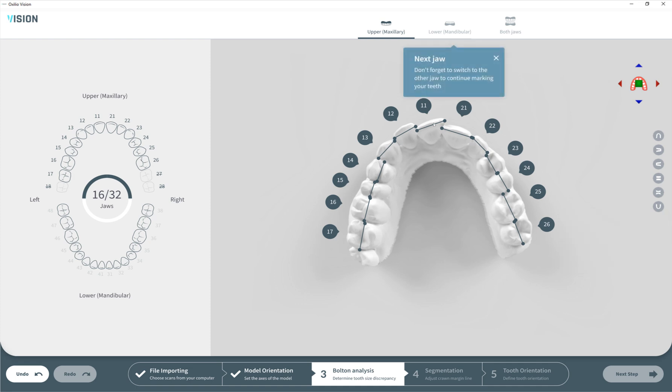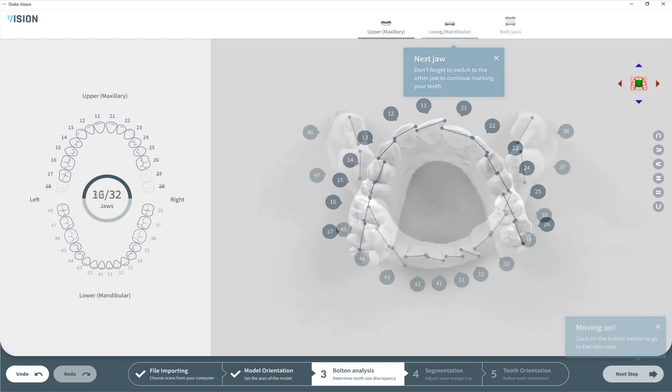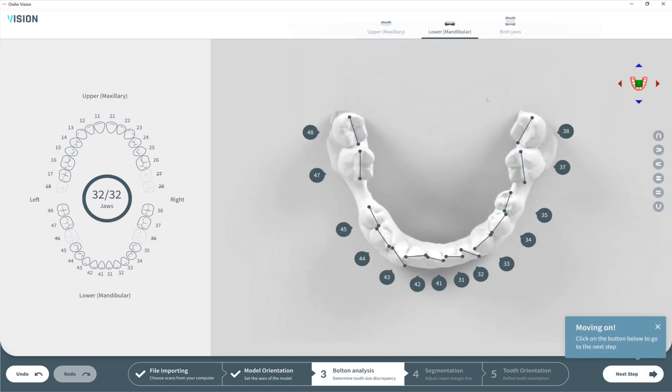Now we need to do the same for the lower jaw. Here everything is done. On the left you can see a map where everything is marked correctly and corresponding teeth are highlighted in this view. Step number three is complete.